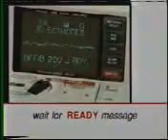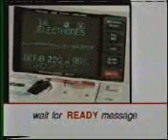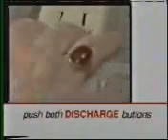It is very important to clearly remember the steps involved and perform them accurately without undue hesitation. Turn the ZOLL to defib on Analyze as it is being brought to the patient. Attach the stat pads in the proper manner. With everyone standing clear of the patient, press the Analyze button. If shock advised, push the charge button. Wait for constant charge tone and ready message on screen. Make sure all personnel remain clear. Look at the patient and press and hold both discharge buttons.